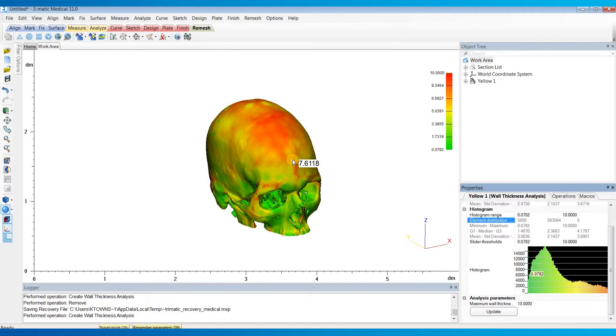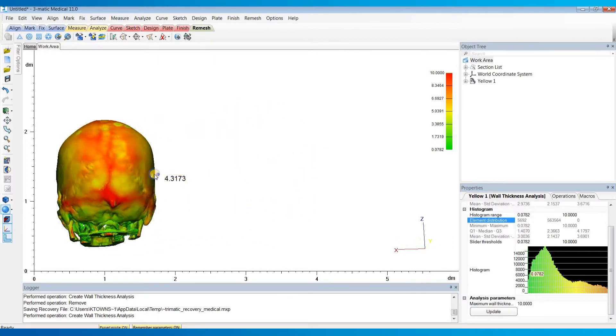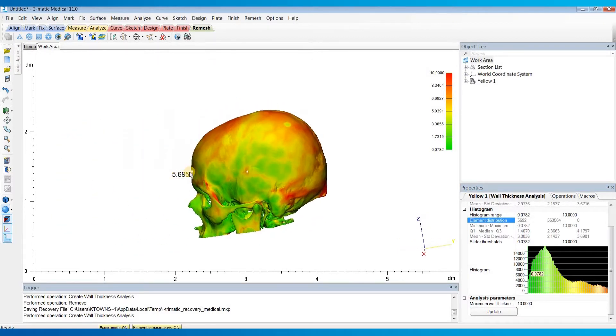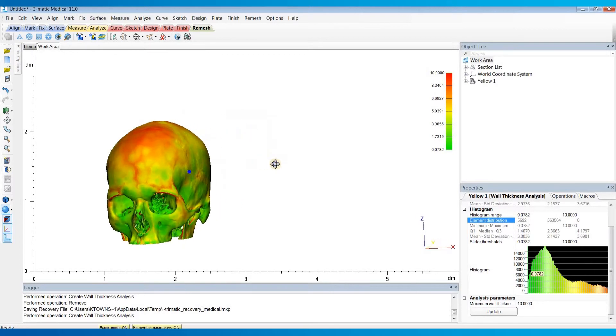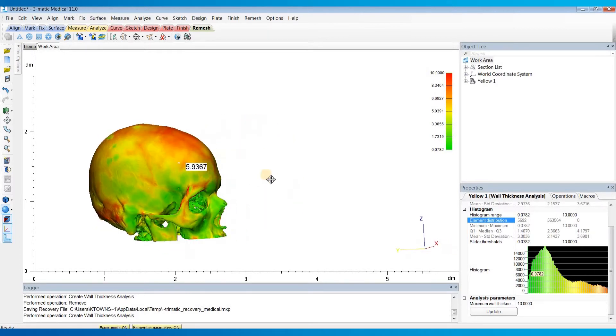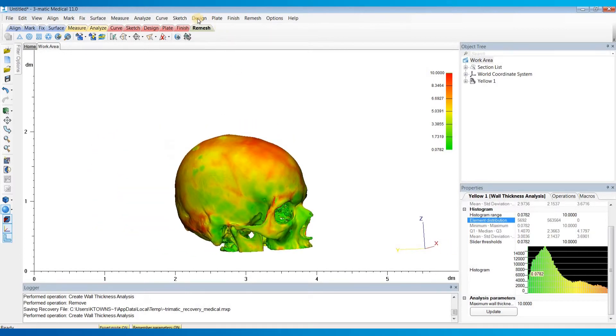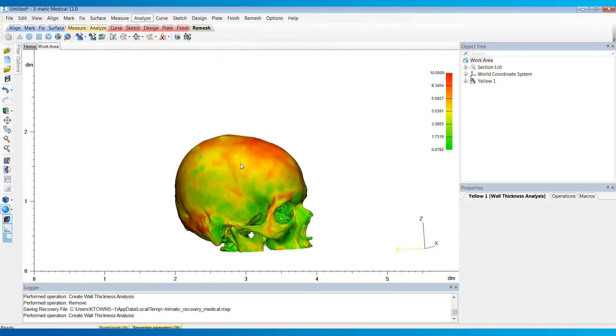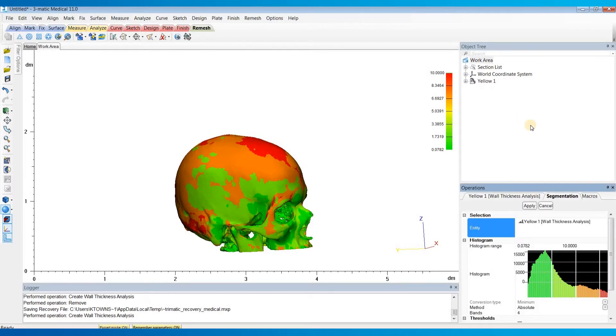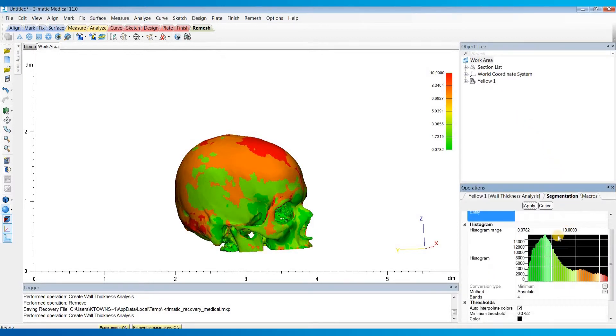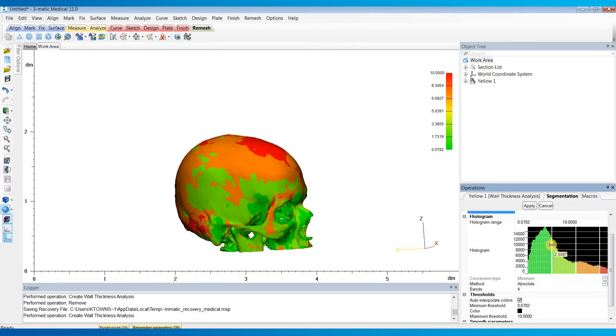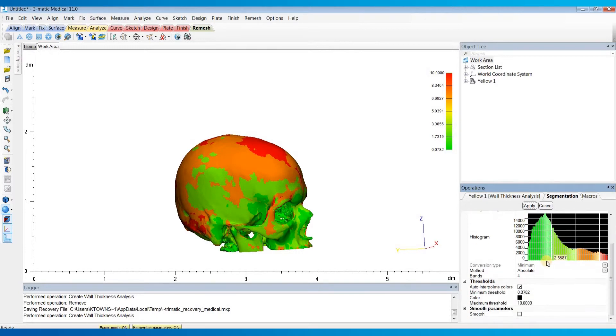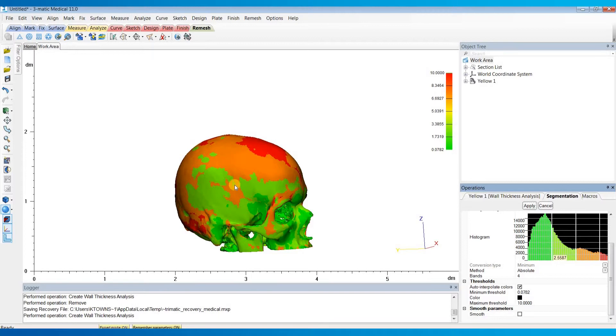Next, if you'd like to export out this color map and print your model with this overlaid onto your skull, you can do so by going to the Analyze menu and choosing Segmentation. So this tool will bring up some more parameters here that you can set. So the number of bands is basically how many different colors you'll be using to represent the different ranges of thickness values.